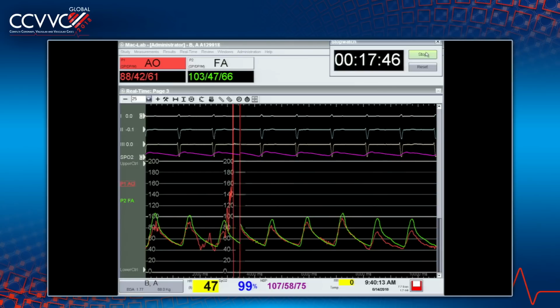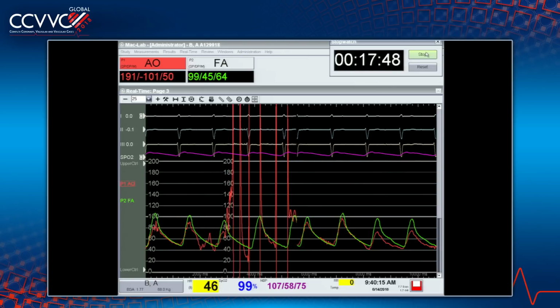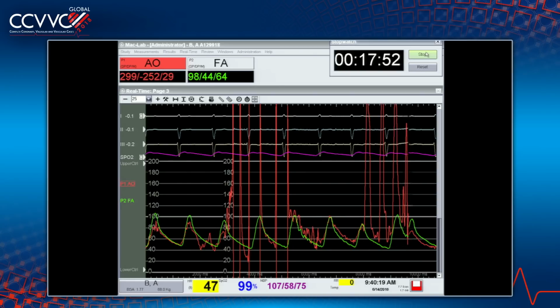So there's no 4.5. Now we are going to cut the circumflex and then go to our mini crush technique and use the app. John?